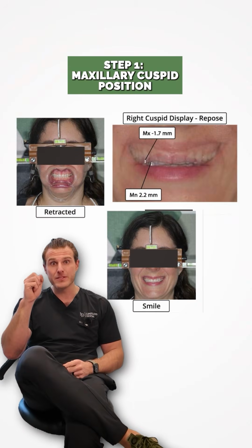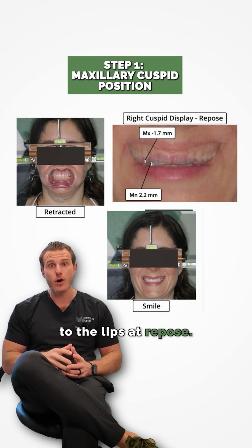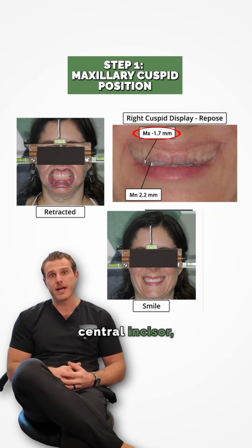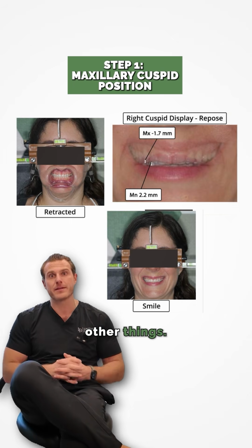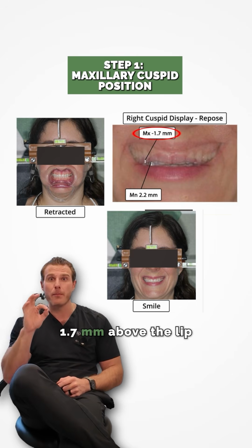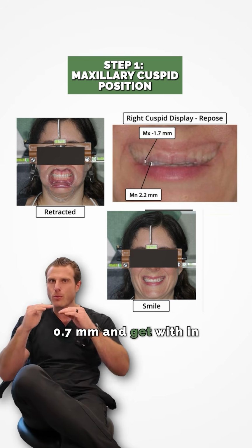Step 1, the maxillary cuspid position. This takes into account the right maxillary cuspid in respect to the lips at repose. This number on average is anywhere from -1 to 1. Most people use the central incisor, but if you look at the studies, it can be a bit more variable depending on lip form and a few other things. In this case, her cuspid is at -1.7. So that means 1.7 millimeters above the lip in repose. So if we think about the averages, we can actually add 0.7 millimeters and get within the average.